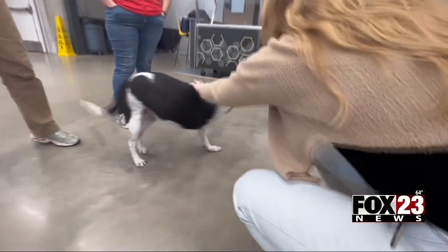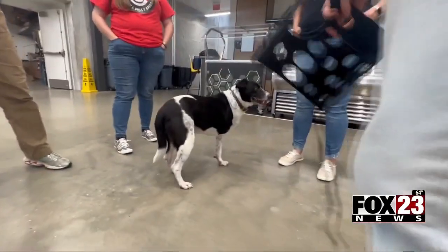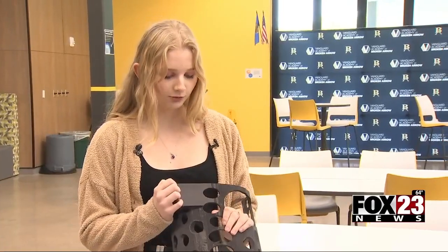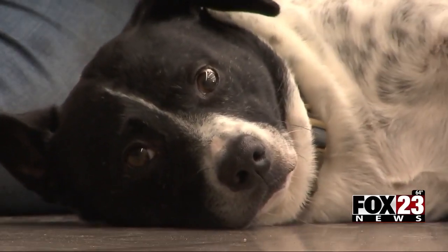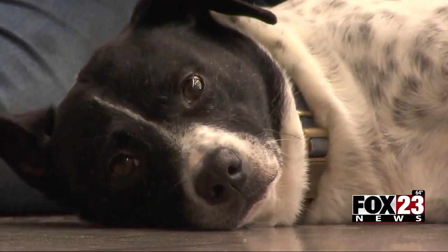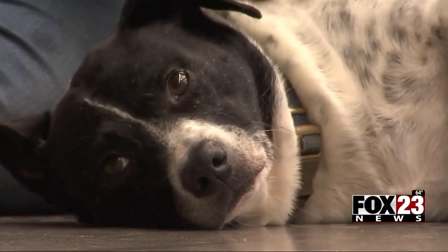Cain the dog is getting help from a new friend. Broken Arrow Vanguard Academy junior Brooke Tyler wants to outfit Cain with a new prosthetic leg. This is where the dog's able leg will go, and this is where the prosthetic will go. Cain lost his leg in an accident when he was only six months old.